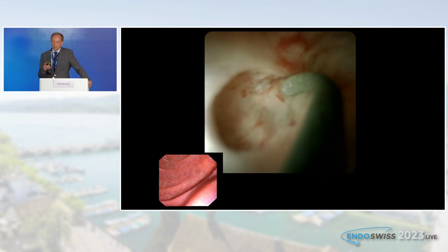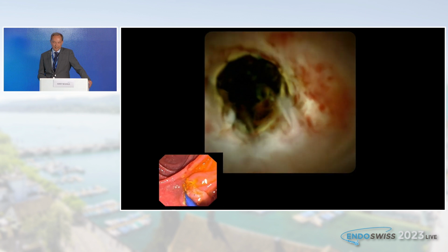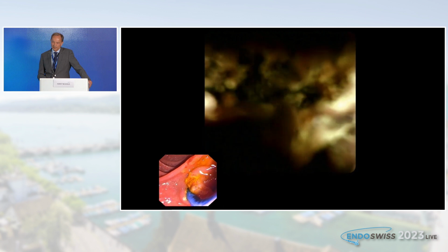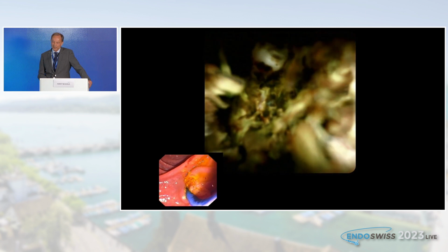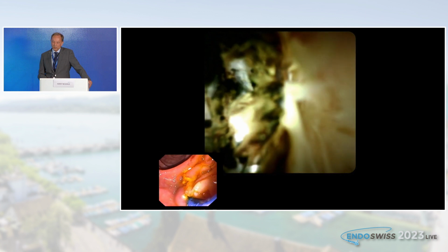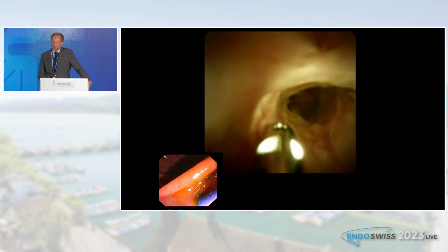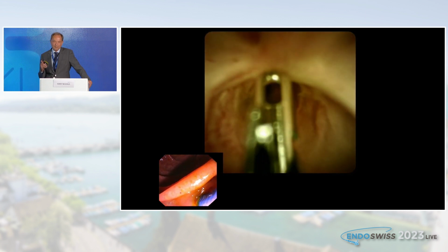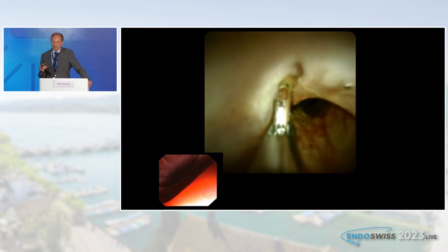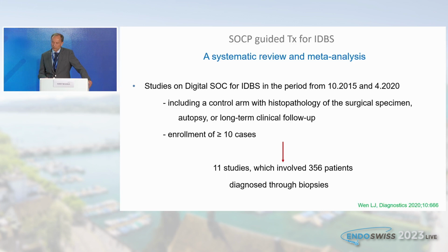Another advantage of cholangioscopy is that we can proceed to targeted cannulation. So it would be impossible to pass this stricture just with ERCP techniques. In addition, we can here proceed to fragmentation of intrahepatic stones proximal to the stricture. And as you have seen, after dilatation, it's very difficult to characterize. But we have, of course, the advantage that we can take biopsies under direct visual control.